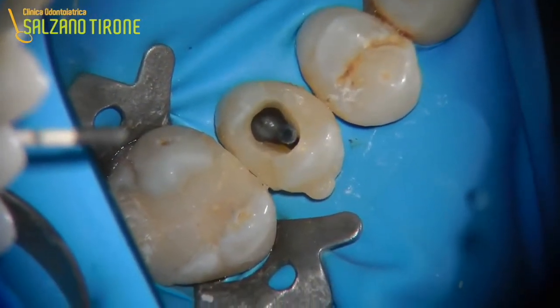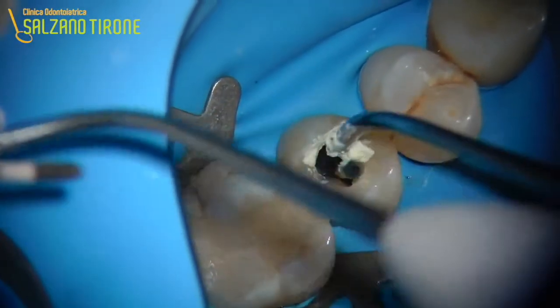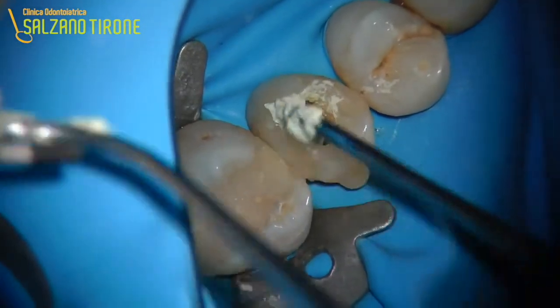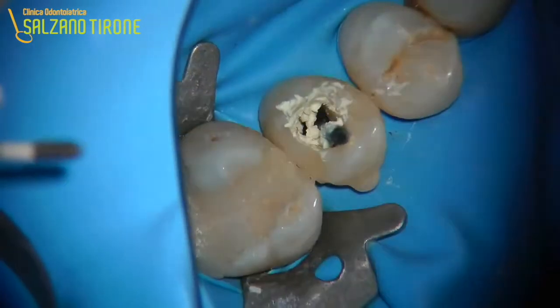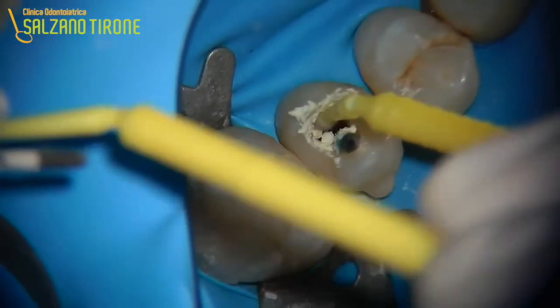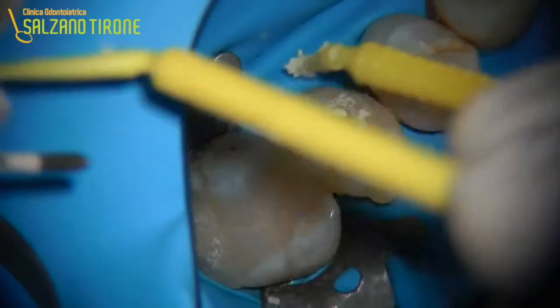However, both MTA and biodentin are materials that can tolerate some bleeding and harden in wet environment. Then I start placing some MTA and I prefer to adapt it with some little brushes. Honestly, I never manage to work well with the MTA gun, which always gets stuck, so I put the MTA at the edge of the cavity and I push it down with a brush. Do this several times until you fill all the cavity.